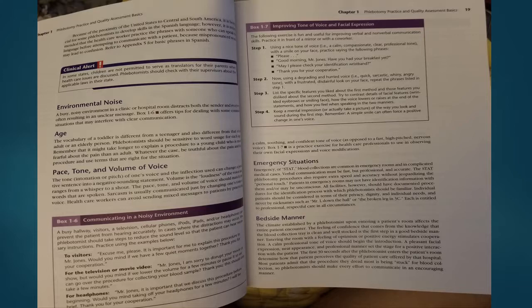The climate established by a phlebotomist upon entering a patient's room affects the entire patient encounter. The feeling of confidence that comes from the knowledge that the blood collection tray is clean and well stocked is the first step in good bedside manner. Entering the room with a feeling of optimism or positive energy stimulates cooperation. A calm professional tone of voice should begin the introduction. A pleasant facial expression, neat appearance, and professional manner set the stage for a positive interaction with the patient.